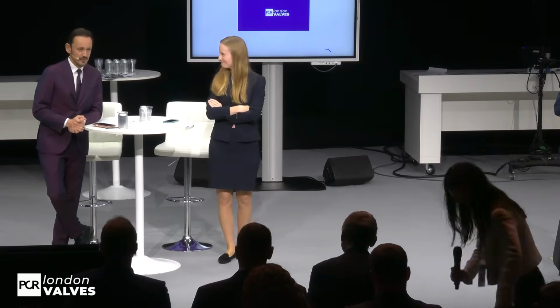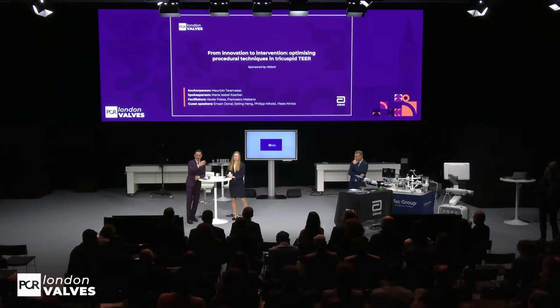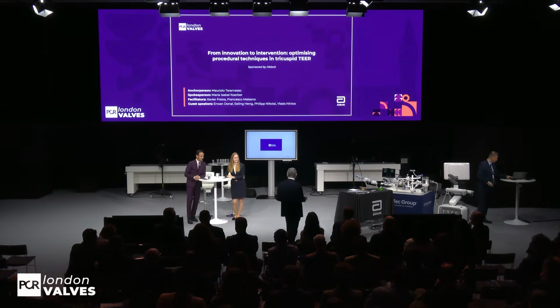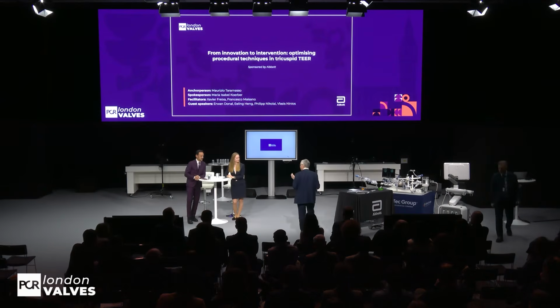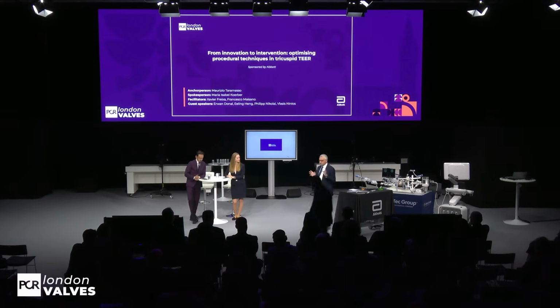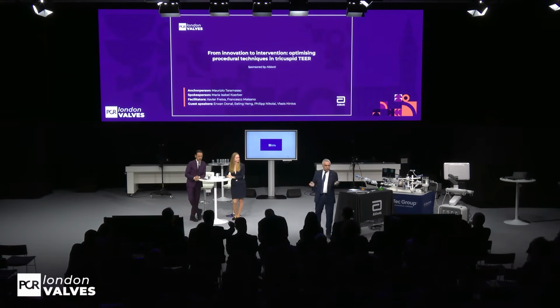Thank you. I think now we try to simulate a similar situation in the simulator. I would like to invite Francesco to the simulator. Yeah, sorry, before we simulate, I am a bit confused. What do we want to learn here? So I have a question for the audience, first of all, because you said we can do it. What do we do?